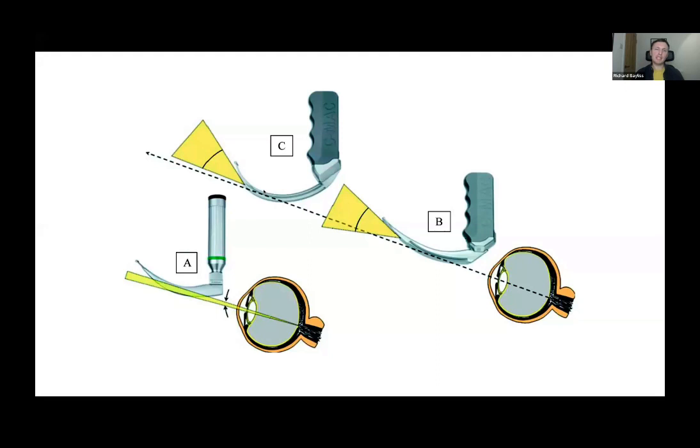You really can't do direct laryngoscopy with these hyperangulated blades, but you can see much further around the corner, so you can intubate patients who would potentially be unintubatable with a standard geometry blade, especially a direct blade.